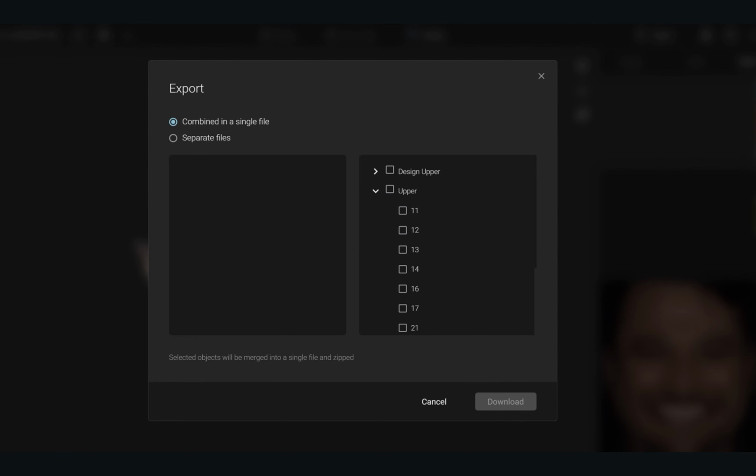And then once you've planned what you need to plan, simply you can export whatever you need in whatever combinations. So you can export the entire design, the entire model, or you can export individualized, segmented pieces of it out. And you can make these beautiful mock-ups that are physically able to be tried in the mouth.